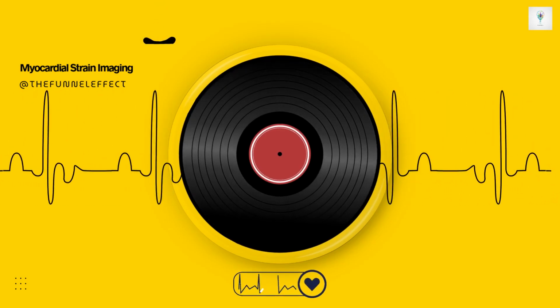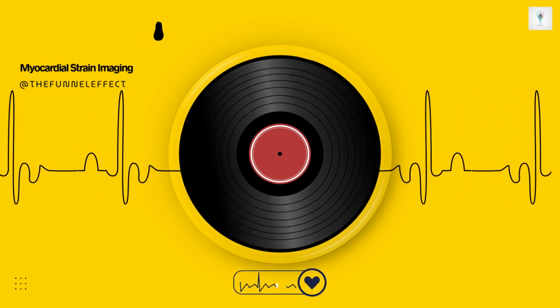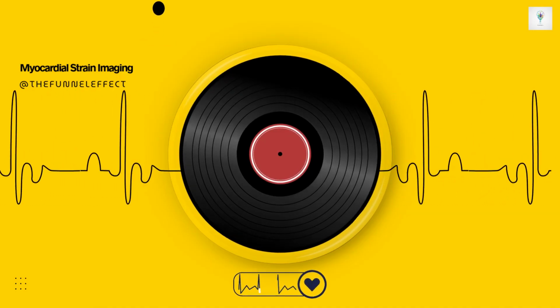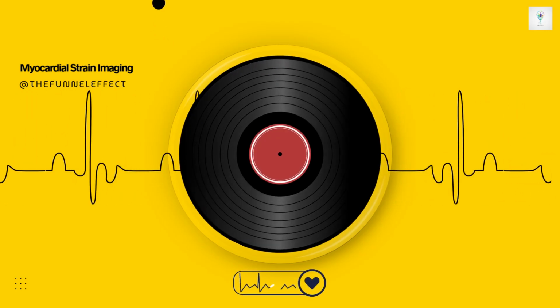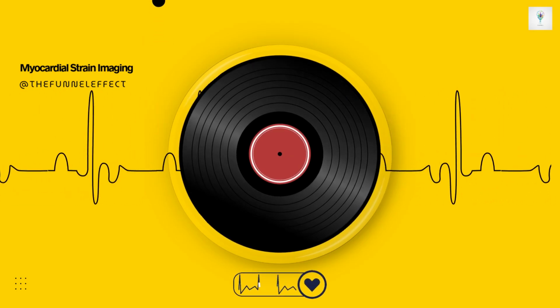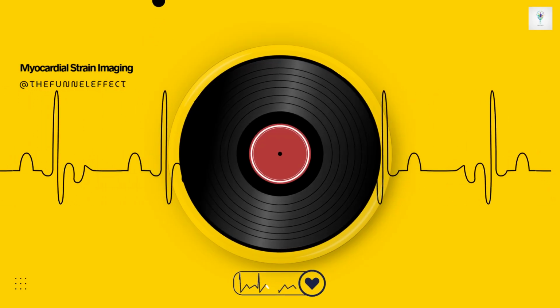That's the crux of it. LVEF is fundamentally a measure of volume change. It gives you one global number. Strain, on the other hand, is a tissue measurement. It tells you about the muscle itself. So it's more fundamental. In a way, yes. It offers complementary information. It lets us quantify subtle, regional, or segmental function that LVEF, being a global average, just smooths over. You could have a normal LVEF, but GLS could be severely impaired because one specific area is damaged.